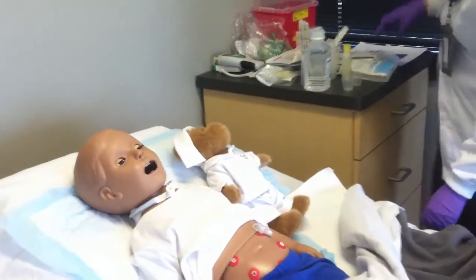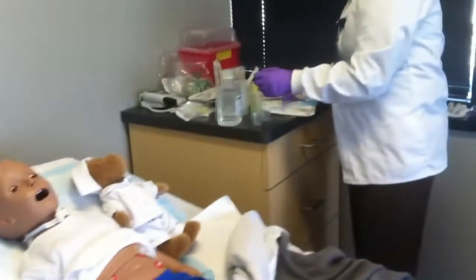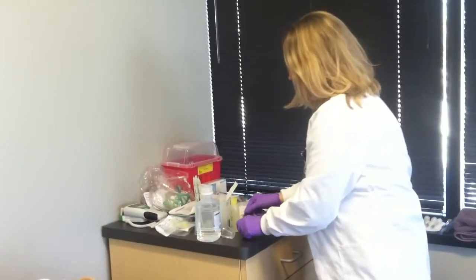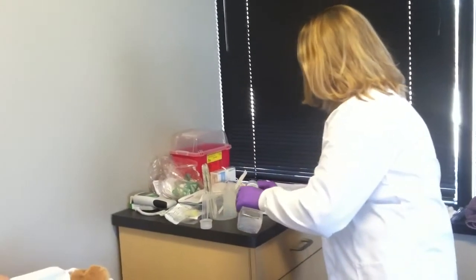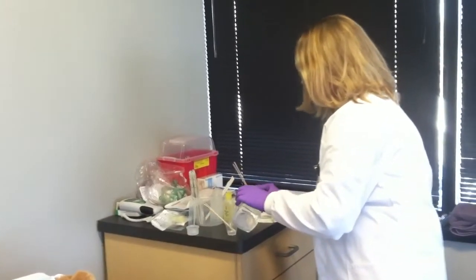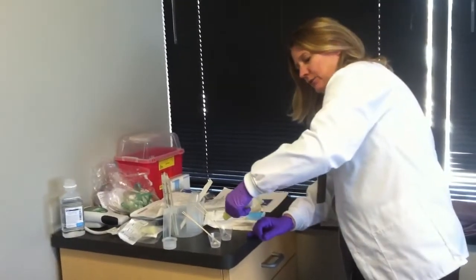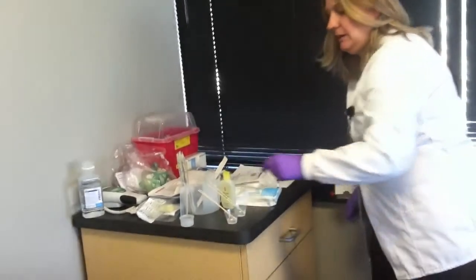Now I'll show you how to do it with Q-tips. Let's say this is only a week old. What I do is I put 2 Q-tips in each cup, and I fill the cup with a little bit of water. The water will hold it from falling over, which is good. And then one of them will become your soapy water. So just put, again, just 1 drop. We don't need very much soap at all. You just swirl it around.